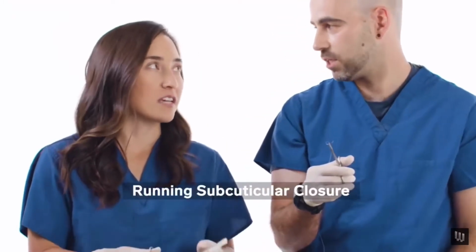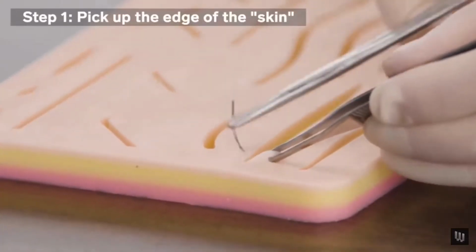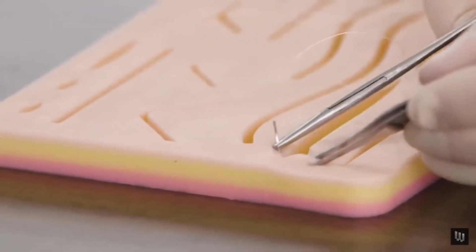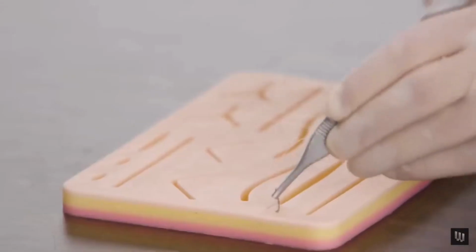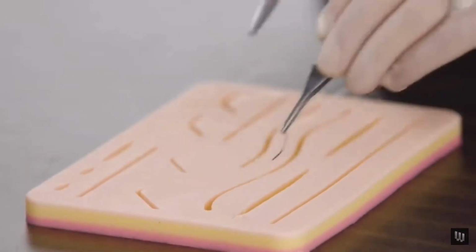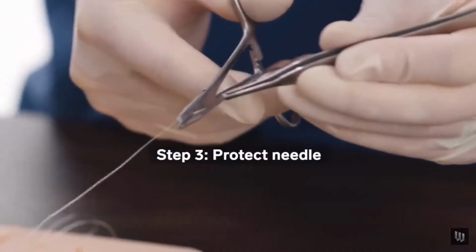Running subcuticular closure. Okay, and this is a nice way to make the skin come together and there's no stitches visible. So I'm gonna pick up the edge of the quote-unquote skin, take one bite sort of right in the apex of this skin. Is bite also a technical term? It is. I'm gonna then what's called protect my needle. So now the sharp end of the needle is protected against this pickups.